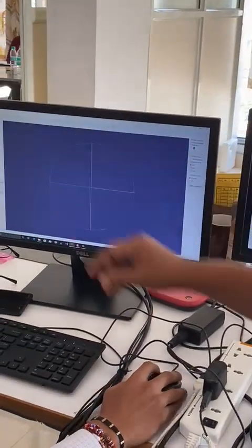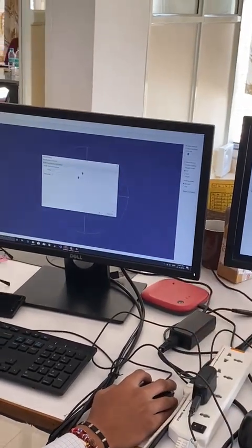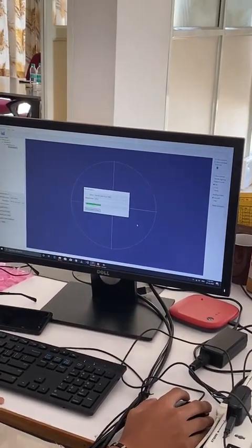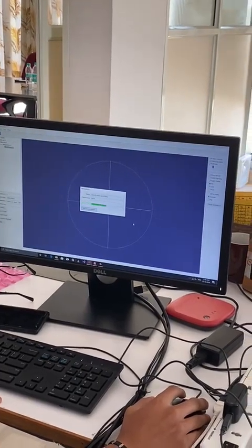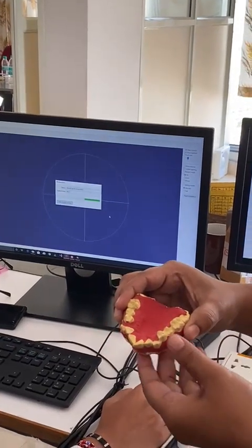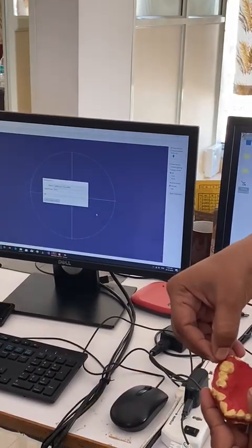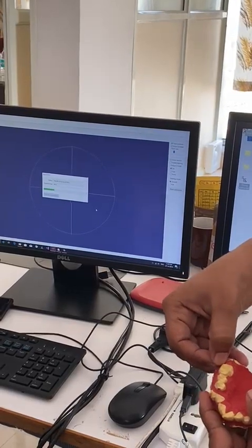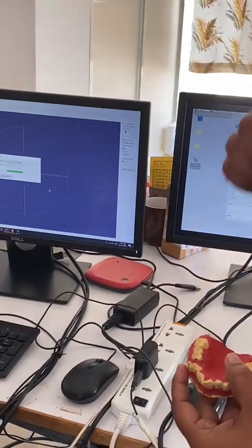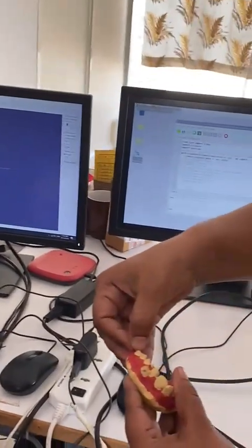So you can create the dense cloud. Now I am creating it. So you have a logic such that it goes to only the extremities, lower and higher? Yes. And in that plane, look for the peaks and valleys. Correct. When it matches this picture and the other picture, there will be a slight deflection of the angle. It will match from this point to that point, and check what the ratio of height is over here. Based on that, it will create the 3D triangulated points. So right now it is creating a dense cloud, and it will start stitching from here.